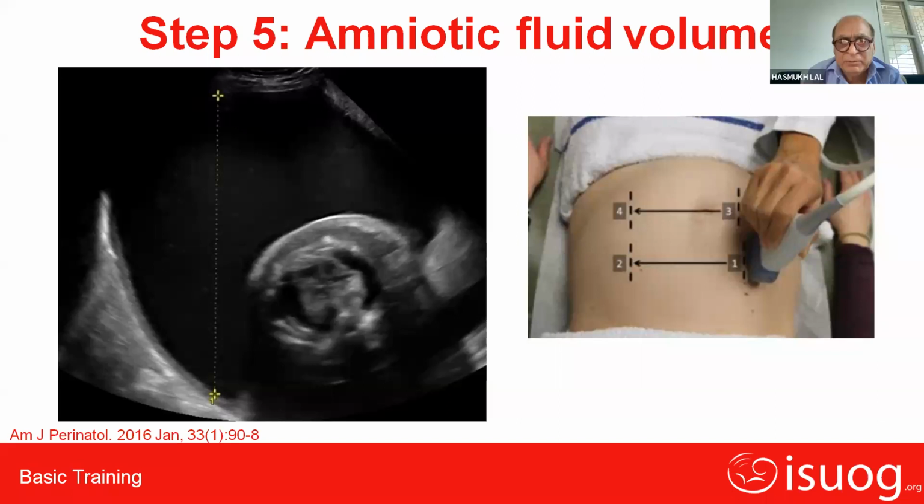There is another question from Sanjay Rai. Particles floating in amniotic fluid, is it meconium? This is a very good question. I like this question very much. There are several particles that can float in amniotic fluid. You can have vernix, which is just the skin being shed off. You can have blood. You can have meconium, and you can have pus. And you cannot tell the difference between any of these. So you have to look for indirect signs of these, but particles are not necessarily meconium. They could be completely normal.